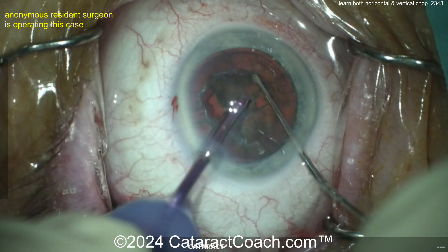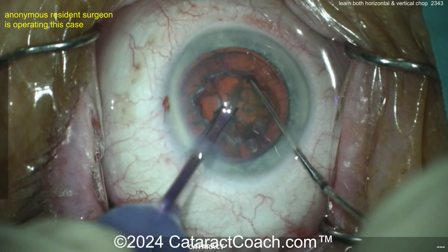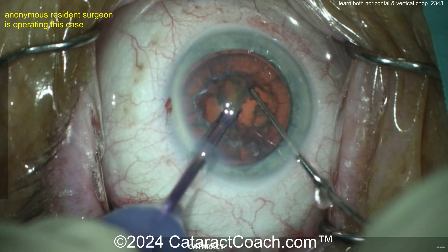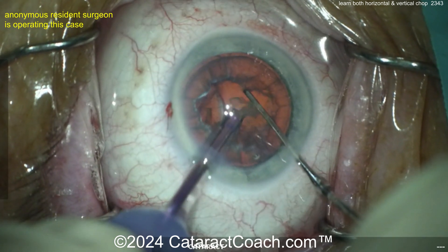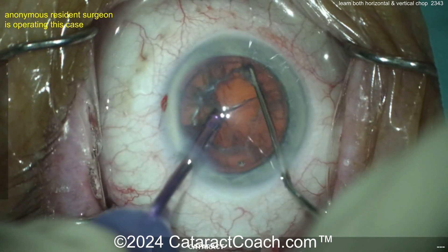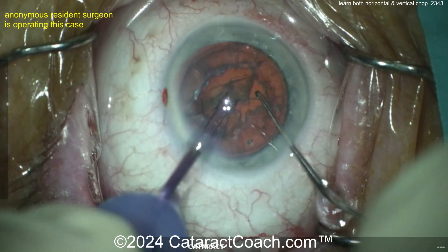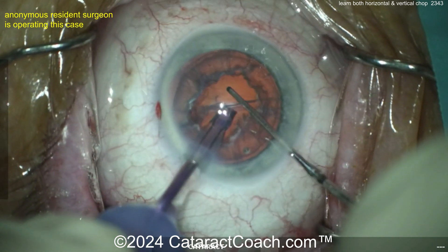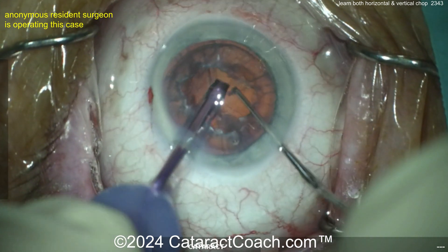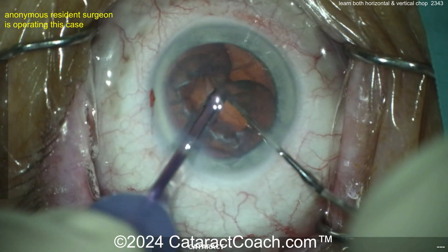The reason the machine makes that noise is for you — it doesn't need to make that noise; the machine can be totally silent. Those sound effects are created for you. It's like driving a car: you can look at the tachometer to see the engine RPMs, but even easier, you can just listen. If your engine's revving high, you know to shift. This is basically the same type of audio clues. Your machine has these sounds so your eyes can focus on the surgery and your ears will let you know it's time to chop — high vacuum. You can adjust the volume setting of that noise, but if you turn the volume off and operate, I promise it won't be as easy.